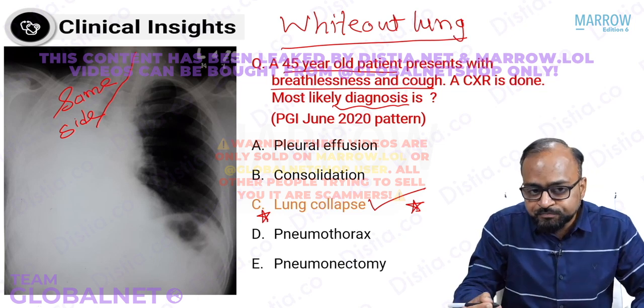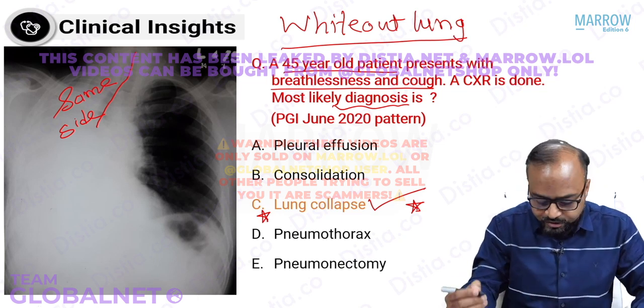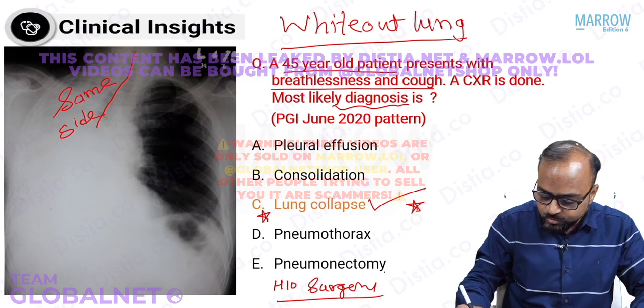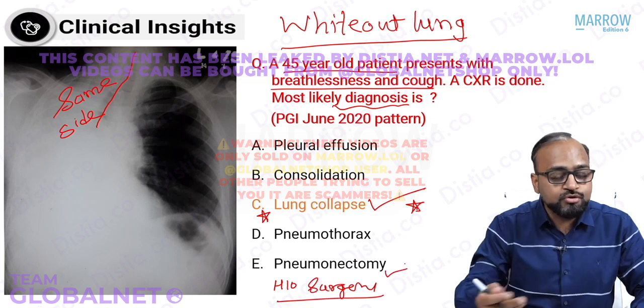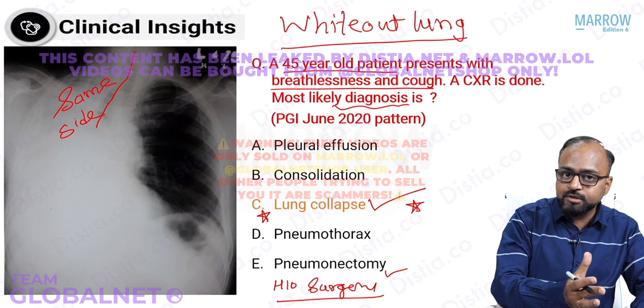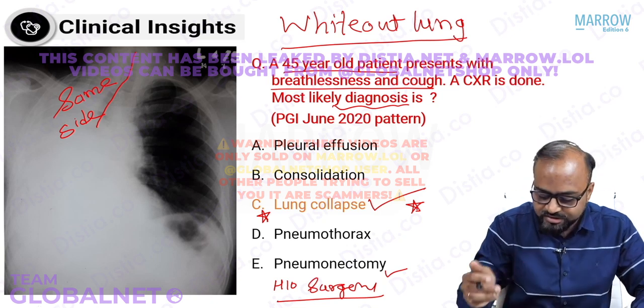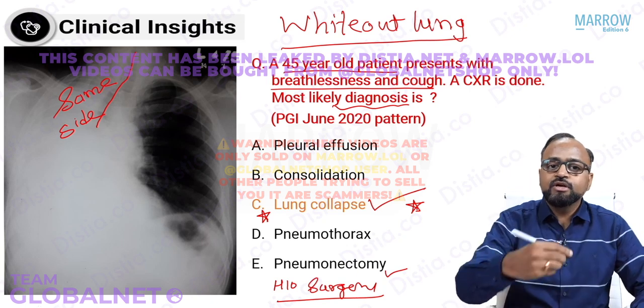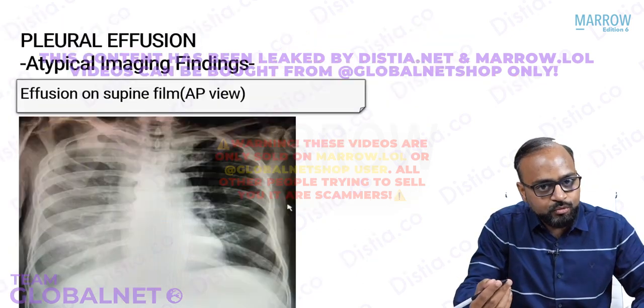If there was a history of any surgery which was given there, then pneumonectomy could also cause volume loss and shifting of the mediastinum entirely to that particular side. In this case, therefore, the answer is lung collapse. Yes, so it is easy enough to characterize the abnormalities in white out lung.